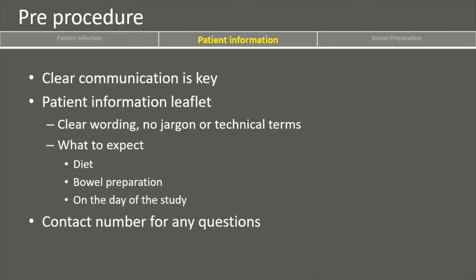And having a contact number for them to call with regards to any questions is really helpful. And this should be directed to an experienced radiographer who understands CTC well, and they will be able to deal with any questions or queries, and that will make the chance of the patient being compliant with the bowel prep much higher, and therefore you're going to have a better quality study.